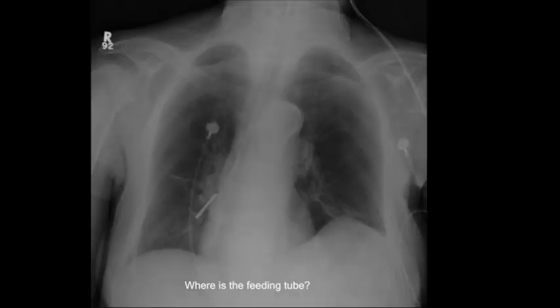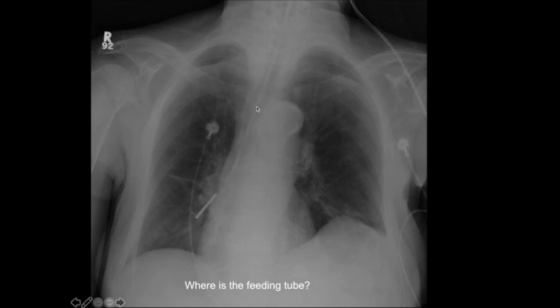Here's another case — where's the feeding tube? We follow the feeding tube down; it should extend into the stomach. Here it is in the right main stem bronchus. Obviously it's important to recognize this, as feeding through this tube would be catastrophic. Call the referring clinician urgently.